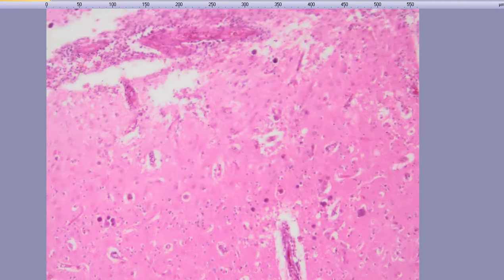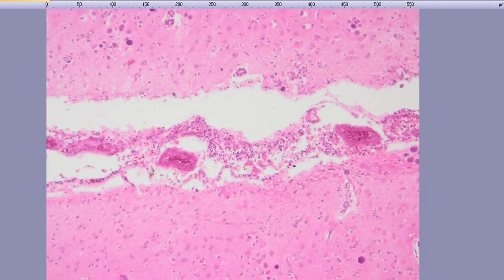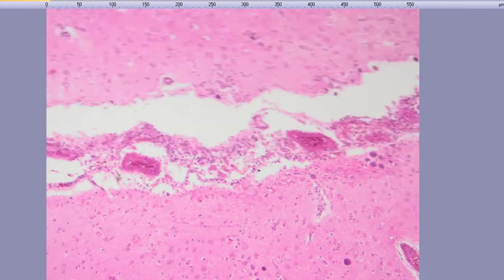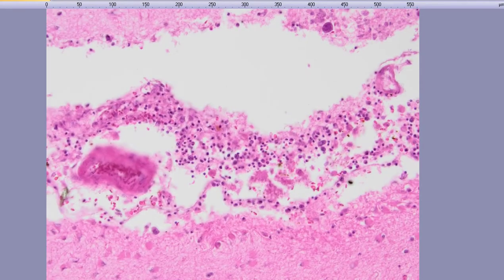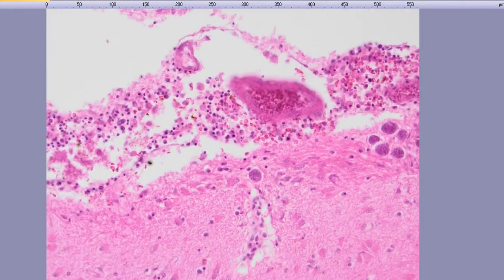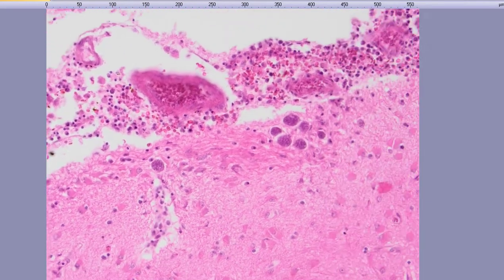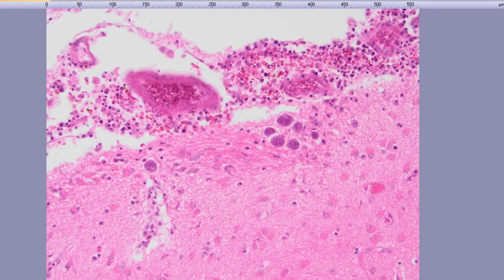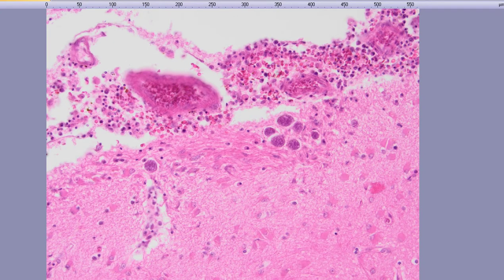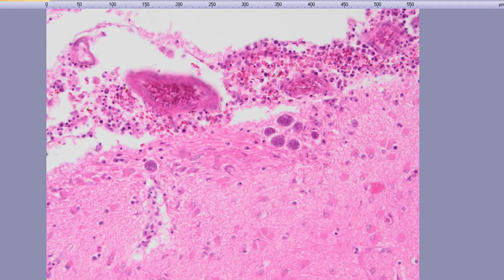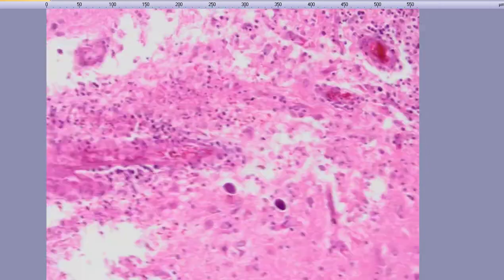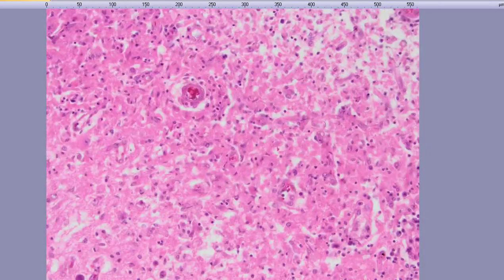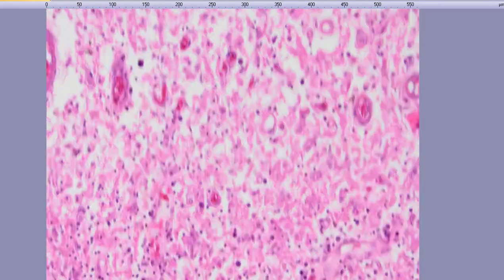You can also see an area of meningitis, sub-pial inflammation here. And again, you can see these cysts right underneath this area of sub-pial inflammation, and in fact, maybe necrosis over here.